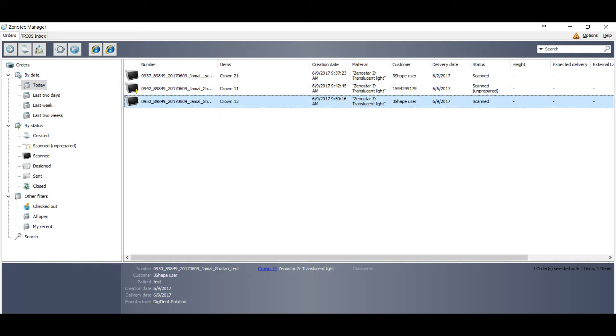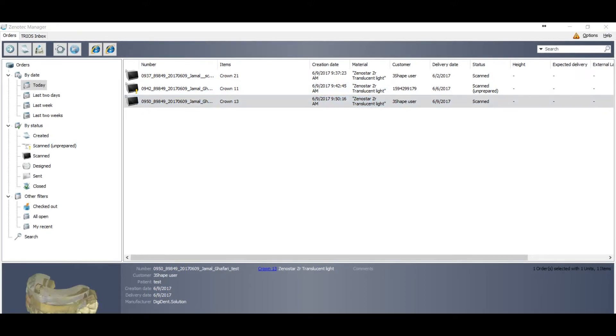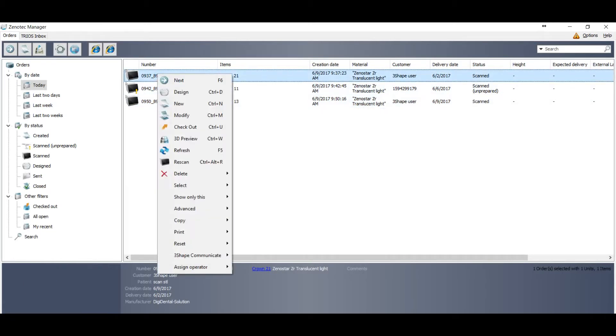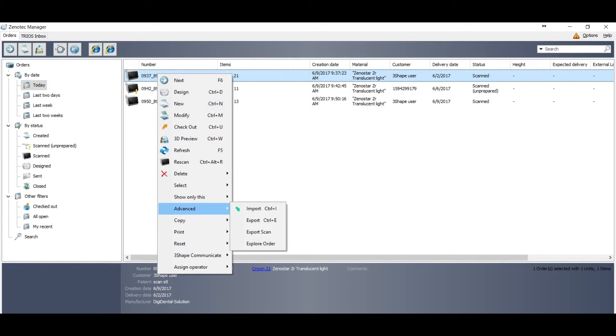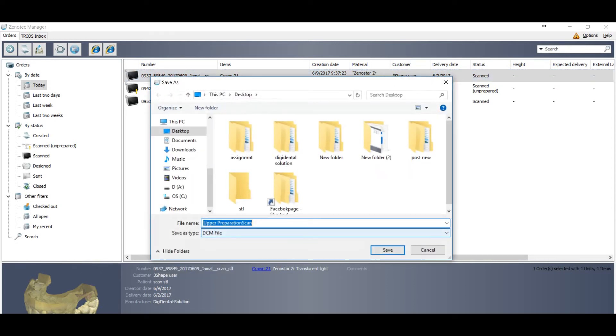So I will show you first a simple way where you can convert DCM files into STL files. Just go to the first order, right click, go to the advanced, and you have one option here: Export scan. This option is available only for the desktop scanner orders. So you just export scan.